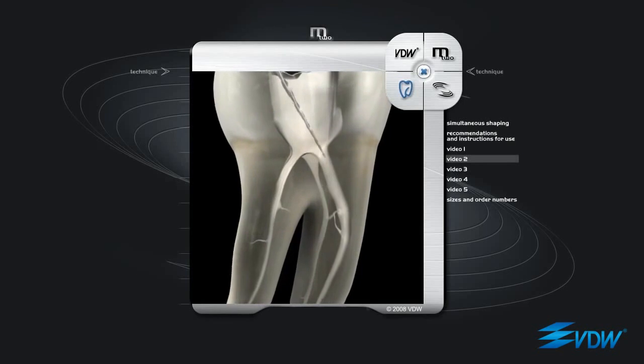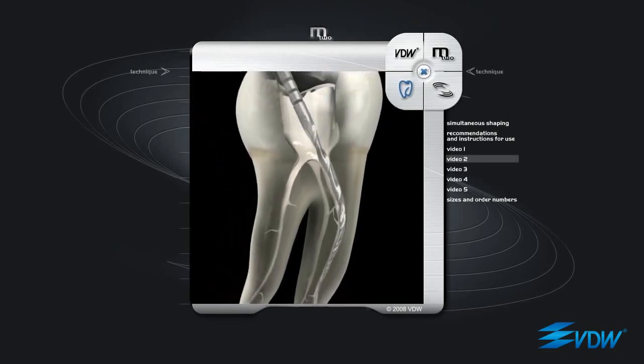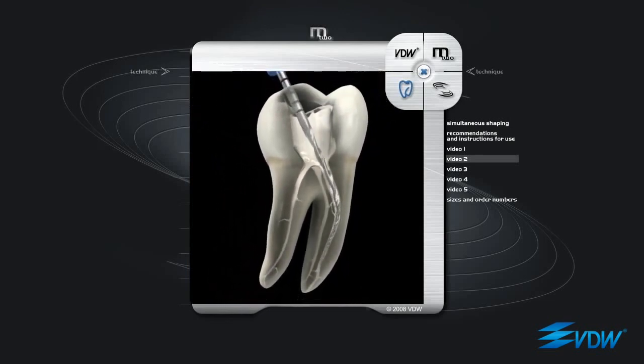The second instrument to be used is M2 ISO 15 taper 05. It is inserted in the same way and will proceed naturally in the same way as the previous instrument. Particular care must be taken during incremental progression that there is not too much pull on the tip of the instrument. Also in this case, if required, passive filing is alternated with incremental progression.